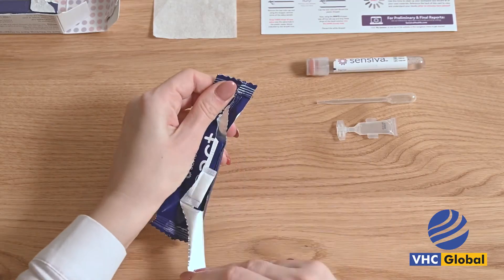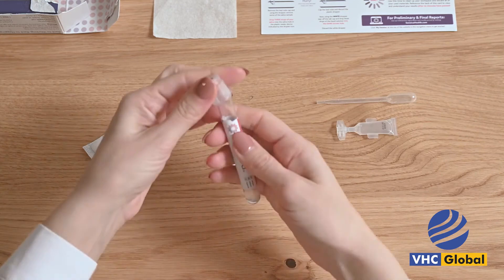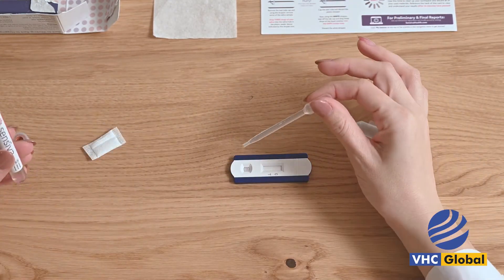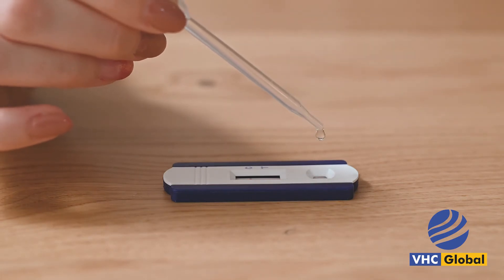Tear open the blue foil pack to reveal the plastic reader device. Remove the device and place it on a flat and clean surface. Add 3 drops of your saliva into the saliva hole in the plastic reader device indicated by the droplet icon.